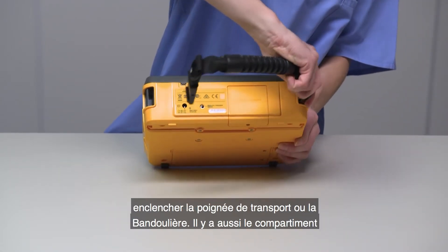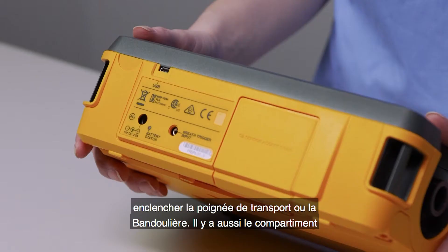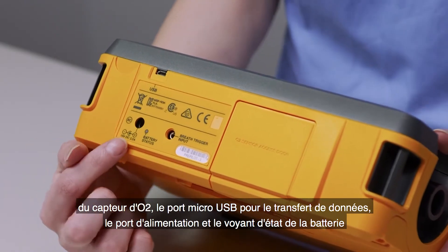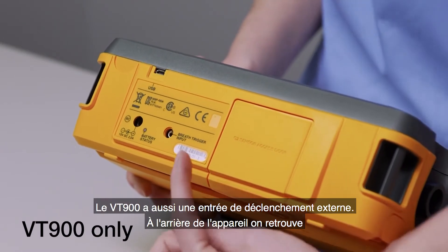On the top are the clips where you can snap in the carrying handle or shoulder strap. There's also the oxygen sensor door, micro-USB port for data transfer, power port, and battery status light. The VT900 has an external trigger input as well.